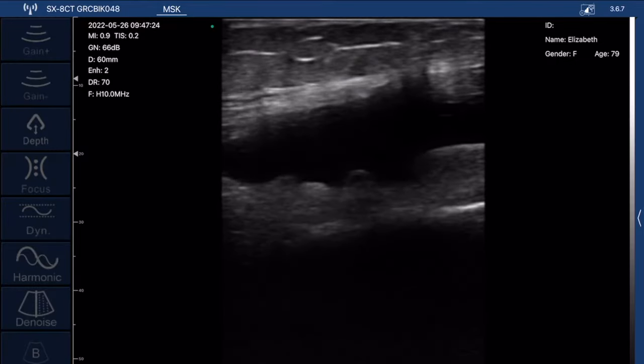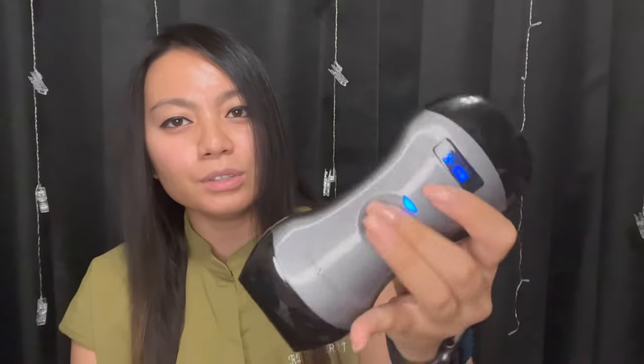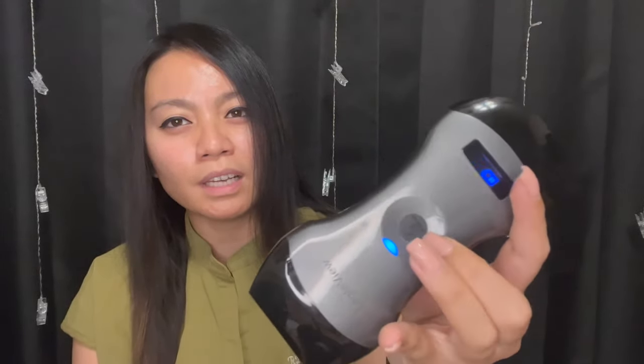If you're interested in this probe, all you have to do is push this button and it turns on. Right there it tells you the battery life and whether it's connected. You just hold the button down to switch probes — if I want the linear, I hold it down and it switches. It's just that simple.